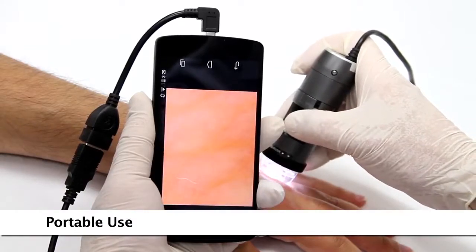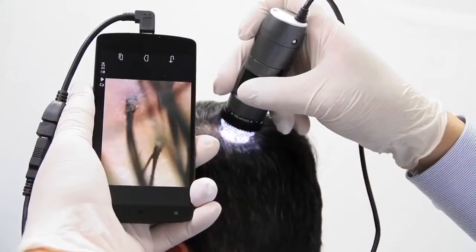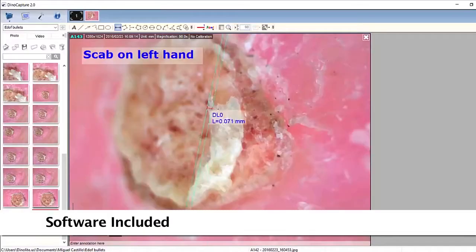The Dynolite is a handheld microscope camera with most standard models going up to 220 times magnification and high magnification models going up to 900 times. These models are connected to a computer via USB and include easy-to-use software that allows users to capture images and video, as well as many other basic and advanced features.